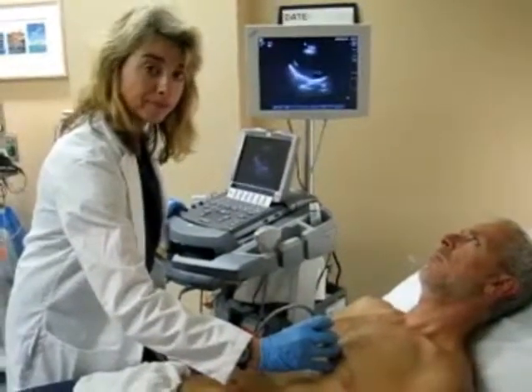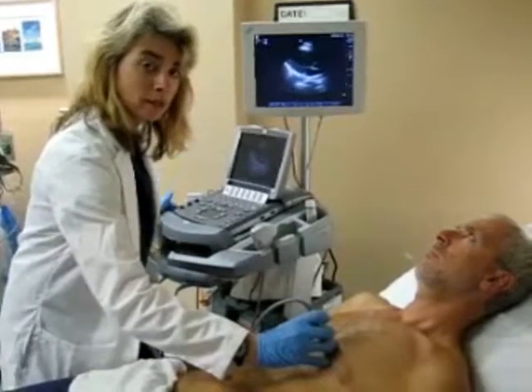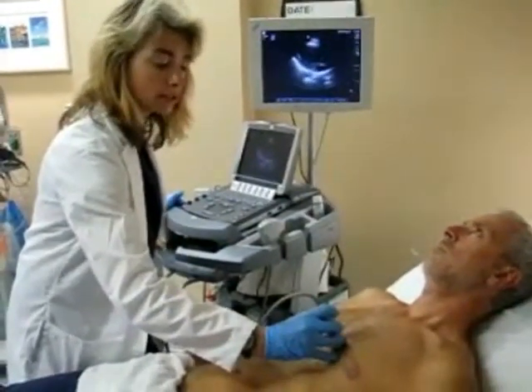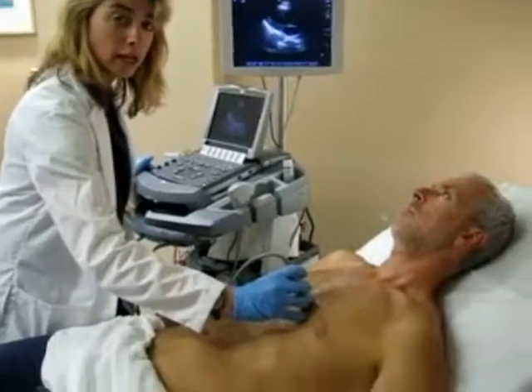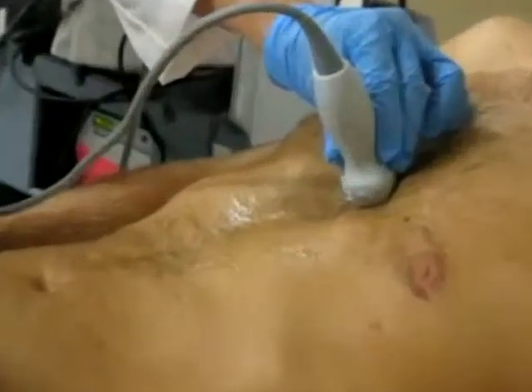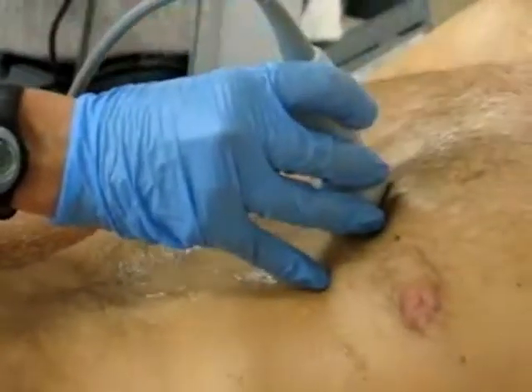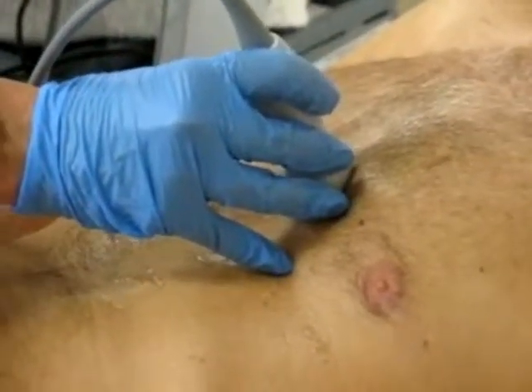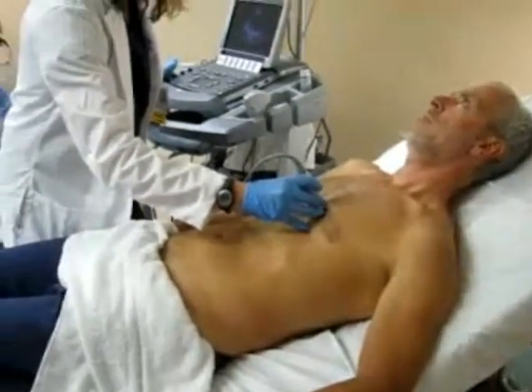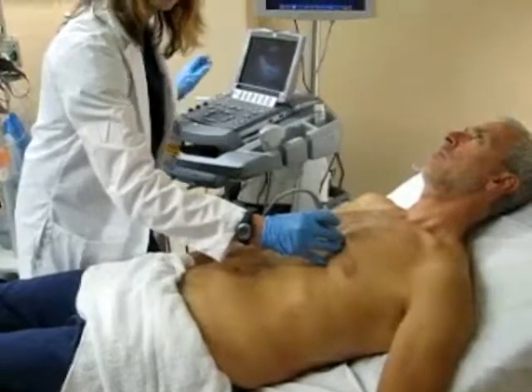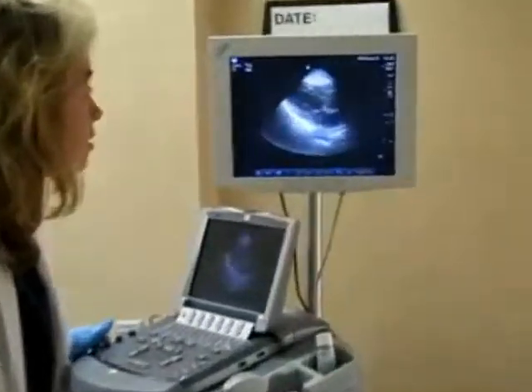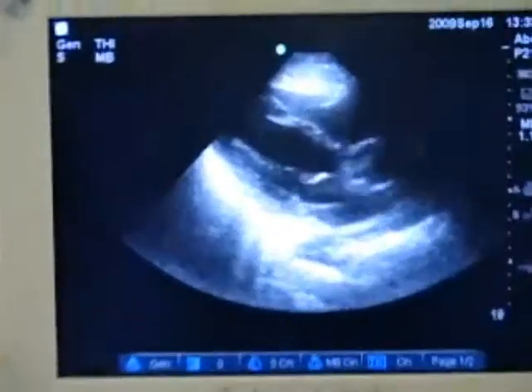In order to do this, using the same presets used for the rest of the FAST evaluation, the dot that we showed you before has to be oriented towards the patient's left hip. When that's done, it follows standard cardiology protocols of having the heart rotated on the screen so that the right ventricle is anterior and the apex is to the left of the screen.